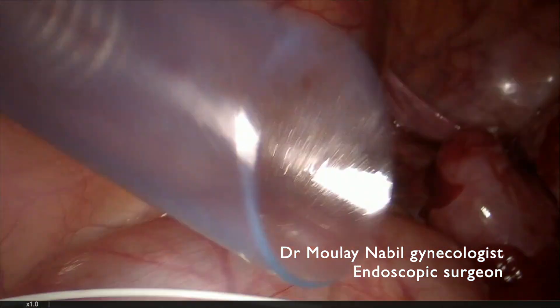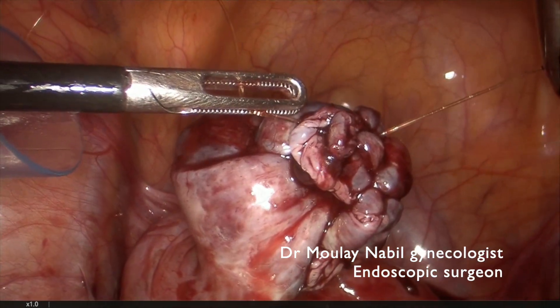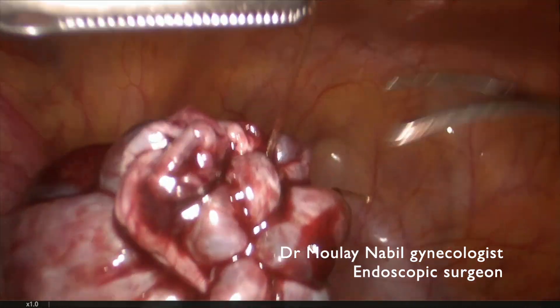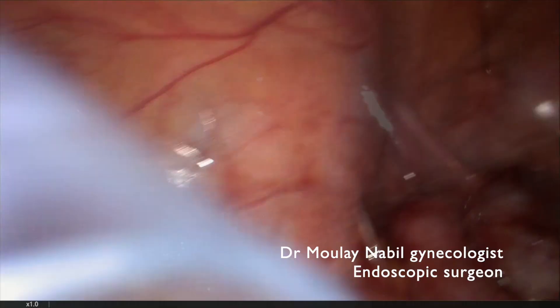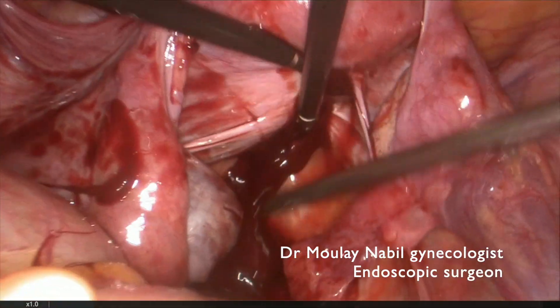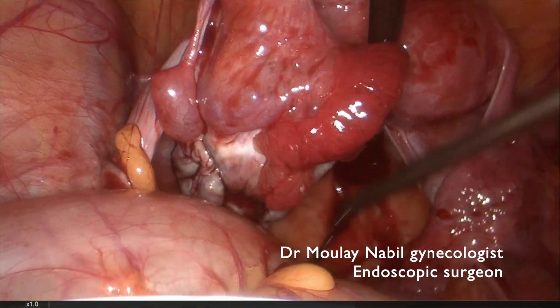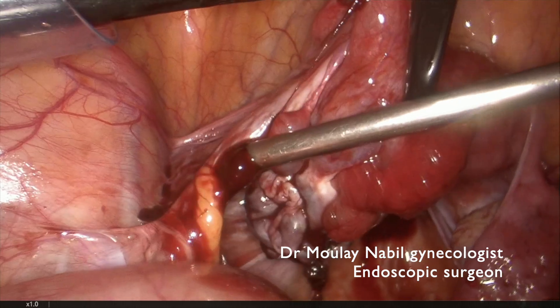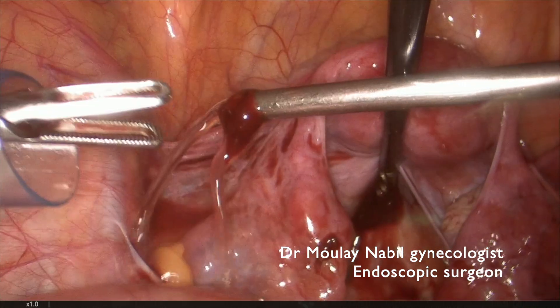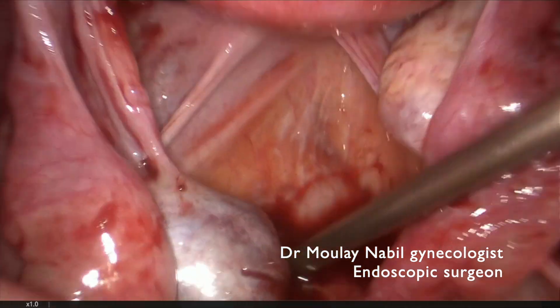Now it is time to clean the pelvis and remove the cyst remnants. You can see the pelvis is cleaned. We removed the small clots. You can see the tube is completely normal now, with good coloration, meaning there is good vascular reperfusion.